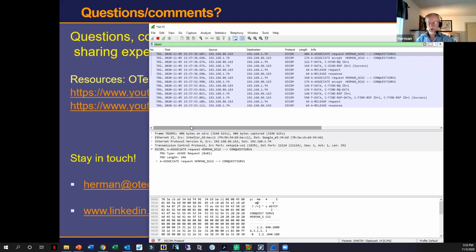I was looking at the different encounter-based imaging options and all the different permutations, and it came up with more than 100, right? So encounter-based workflow is a loaded term. I'm not sure what you want to do with it. I'm a little worried about it because there are so many different options in encounter-based workflow. There's really not a single one that came through yet. There's one defined by IHE for point-of-care ultrasound, right? And one for web-based image capture. Those are the 2 that are defined, but there are still many other options, probably at least 10 or so, right?